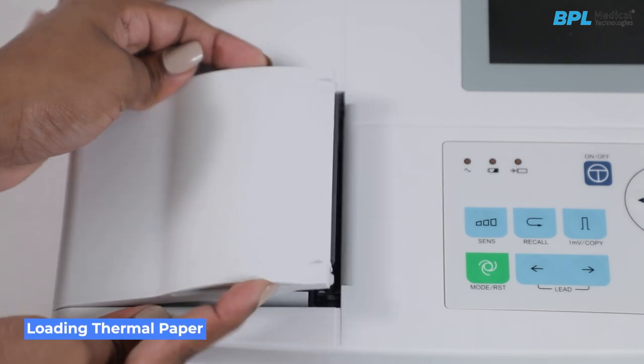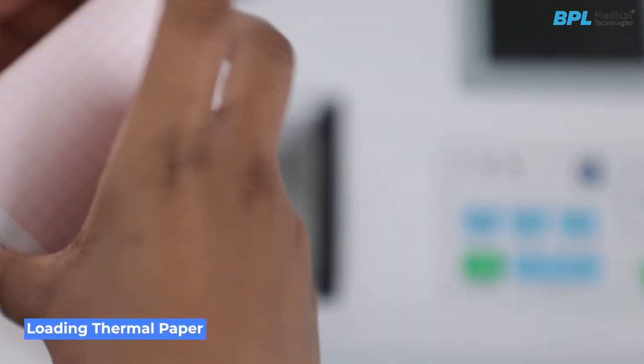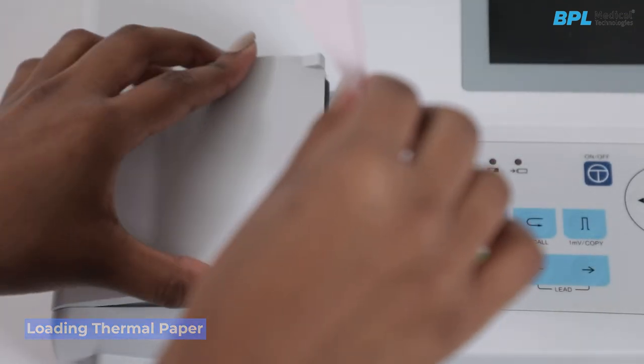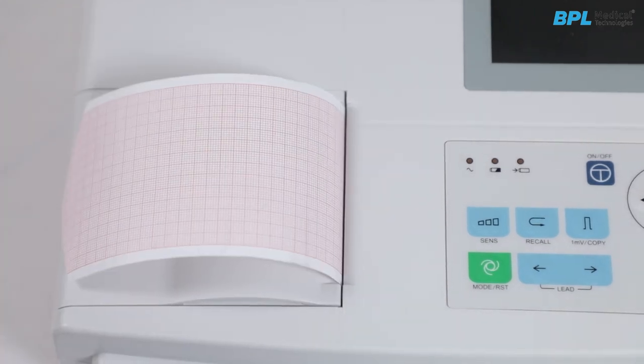To load the paper roll, open the paper compartment carefully. Slot the spindle into the new paper roll and place it in the paper compartment. Close the cover, positioning the paper between the rubber roller and the casing of the device.